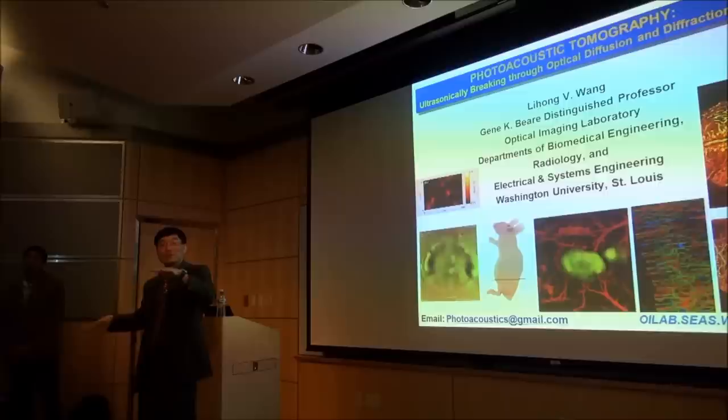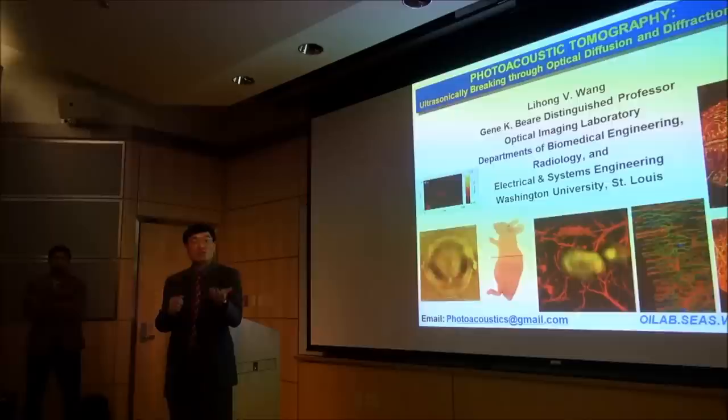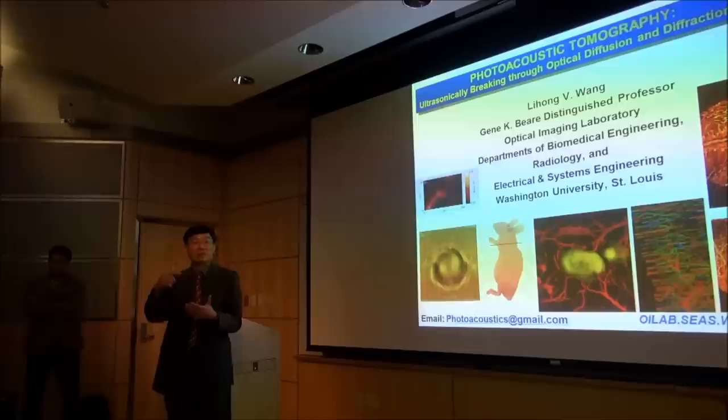Having said that, for clinical applications, you're allowed to go above the ANSI limit as long as you guarantee safety, right? Because you're really benefiting the patients. So right now we try to stay within ANSI so we can go through the IRB really easily, but eventually, if this technology matures, we'd like to go even higher as long as we make sure it's safe.